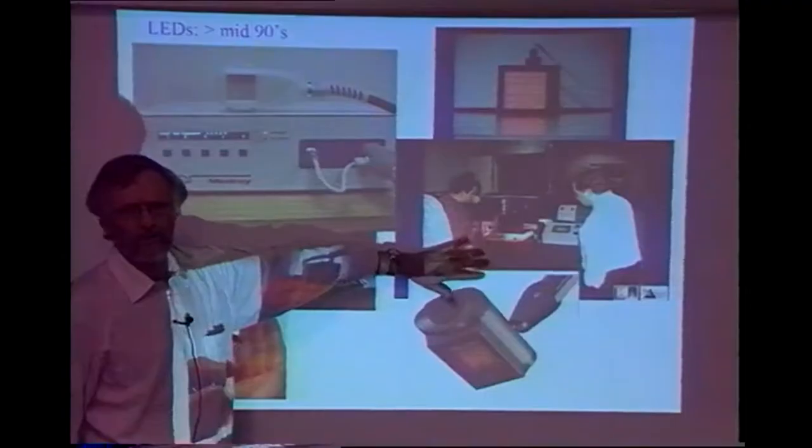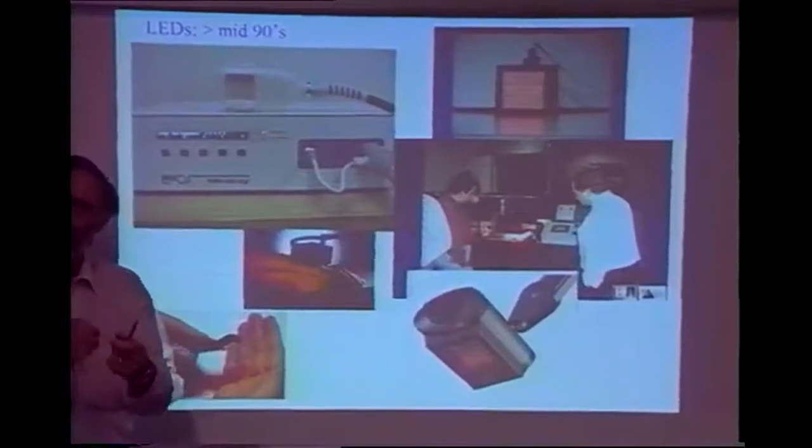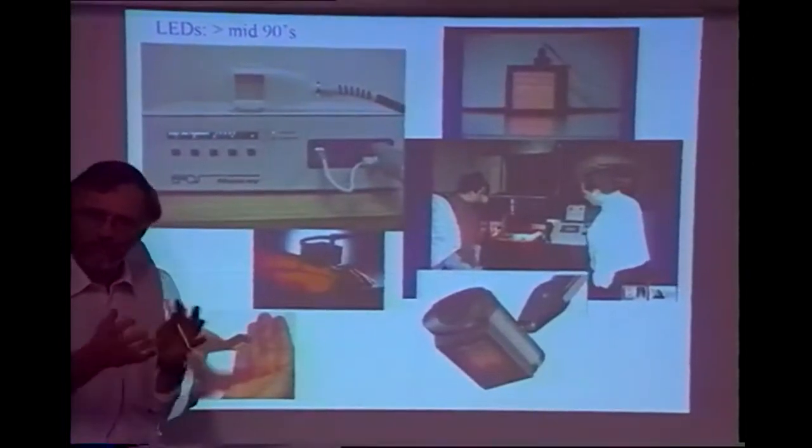Not used, at least in North America now, because it's an expensive way to do it. And there are also concerns because you have to mix the photosensitizer with the blood, and then you have to re-inject. So there's a concern about toxicity. Here's a system developed for clinical surface PDT. Little LED here, developed by a company in England for the oral cavity. So just put this into the mouth and shine it on the gums or the cheek or the tongue. So quite nice technology. So you see the flexibility in the arrangement.